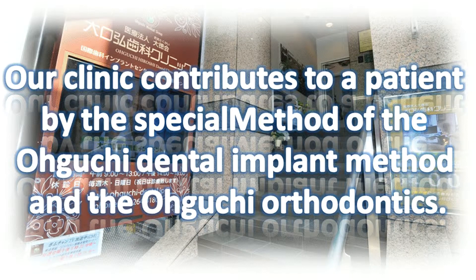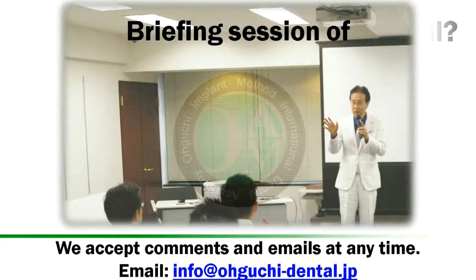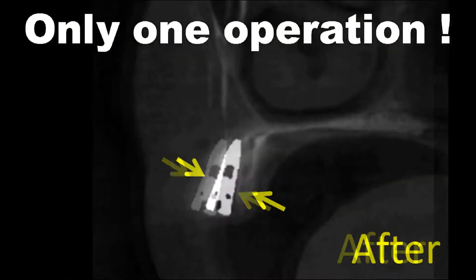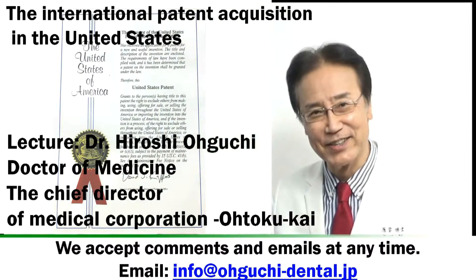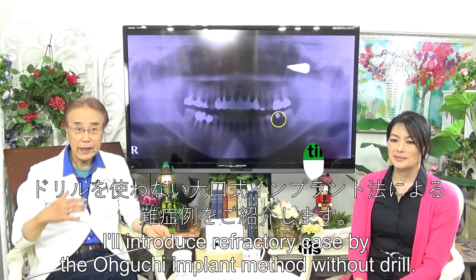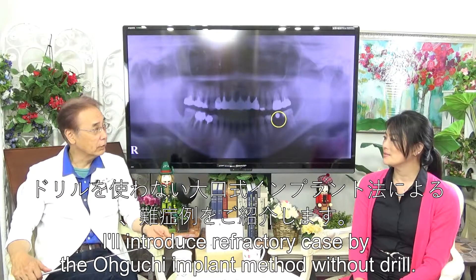Our clinic contributes to patients through the special Oguchi Dental Implant method and Oguchi Orthodontics. This is a briefing session of the Oguchi Side Implant Operation method, which avoids sharpening bone with a drill. Target dentist lecturer Dr. Hiroshi Oguchi is holding this briefing session, introducing a refractory case using the Oguchi Implant method without a drill.